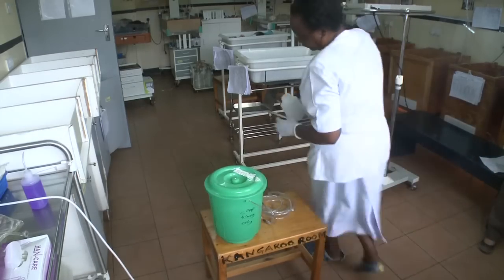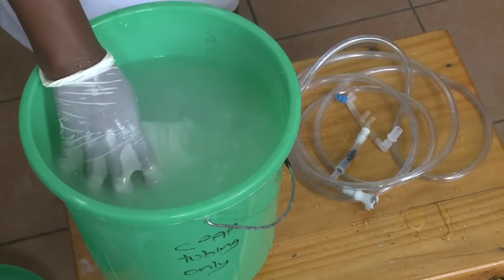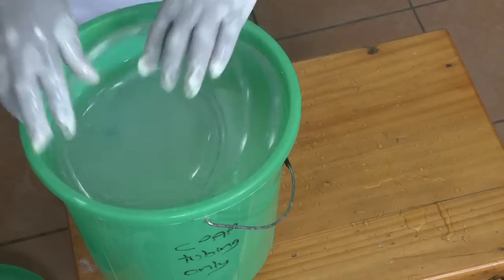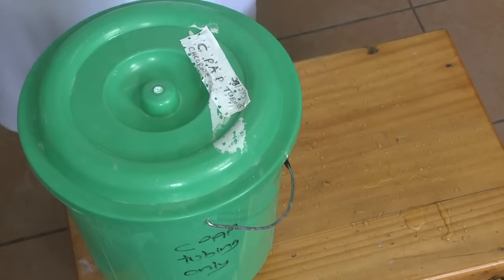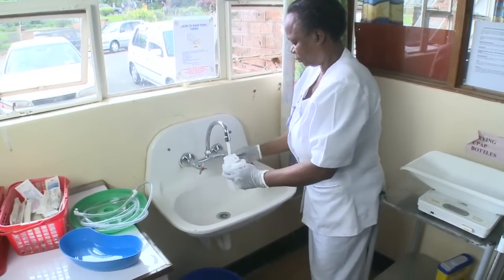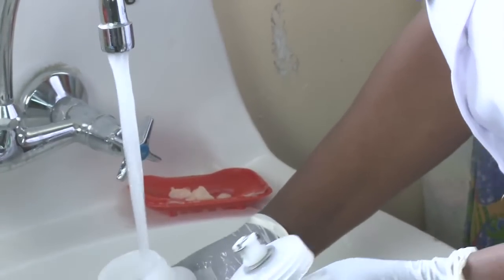Empty the bottle. The tubes and the bottle all need to be soaked in chlorine 0.5. Make sure to immerse the bottle so it doesn't just float on the surface. The tubes need to be soaked for 10 minutes in the chlorine solution.